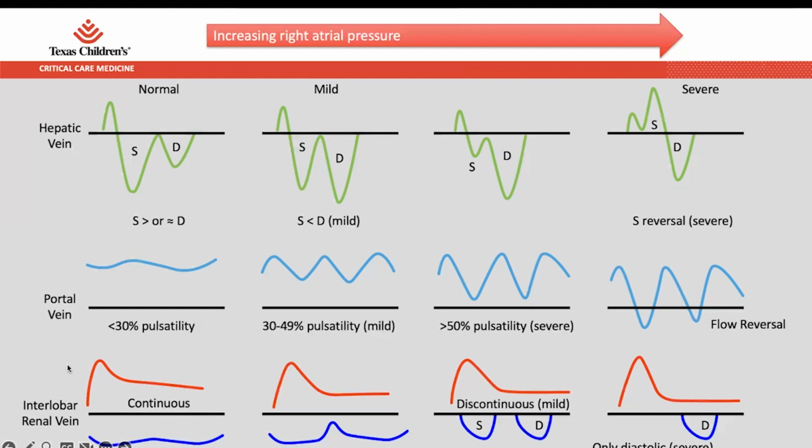So, renal Doppler. The interesting thing about this is that we don't do this a lot in POCUS, but this is something where you really see how Doppler ends up being a little bit more helpful to you with the pulse wave than it does with the color flow and with the 2D imaging, because the pulse wave can be more sensitive to overall movement. So you get your view on the kidney, and then you can put the pulse wave Doppler box inside of the kidney where you see some Doppler flow, and you'll be able to see arterial and venous flow at the same time.